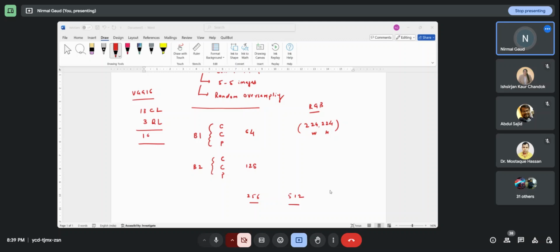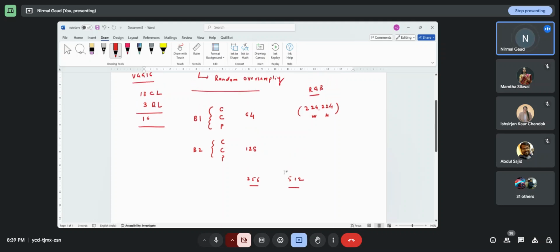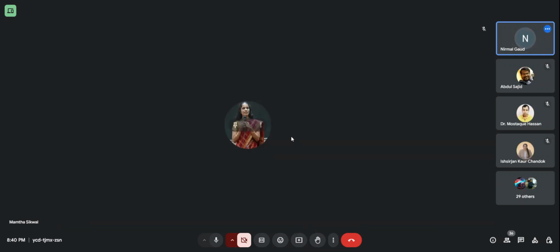That's just a small request, everyone. Madam asked a good question, and I am supposed to answer it, but after some time, because I need to explain pooling separately. So let me continue with my flow. Thank you, madam, for asking the question. I will get back to you. So this is what we have in VGG16. I told you it is expecting colored images. Fine. Now, let me show you the implementation of VGG16.